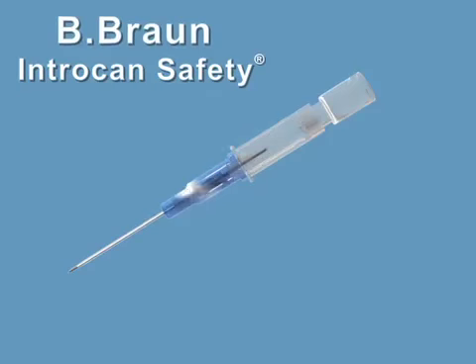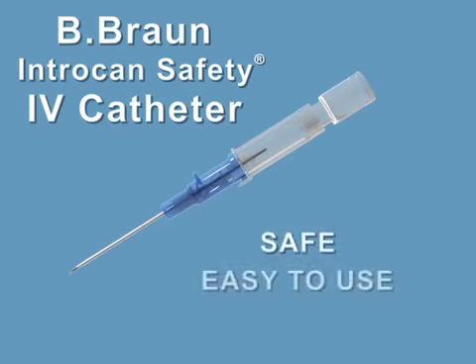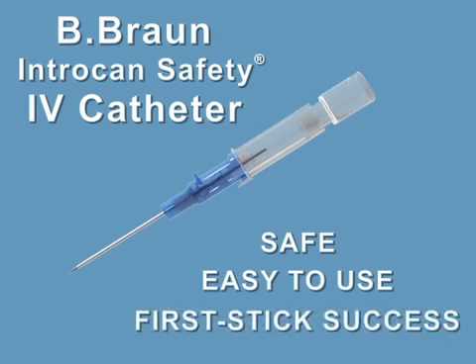The B. Braun Introcan Safety IV Catheter. Safe and easy to use, resulting in first-stick success.